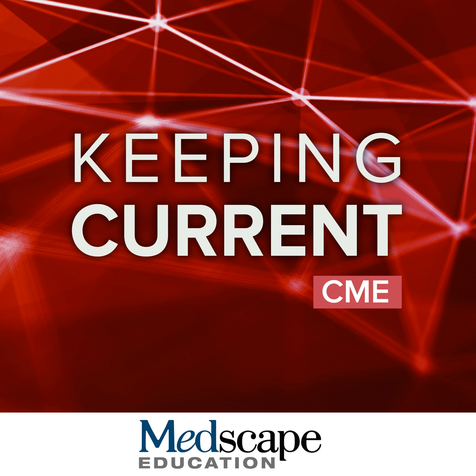There was no associated diffusion restriction. There were, however, a few microhemorrhages in the right occipital lobe. We also see a cluster of microhemorrhages in the left occipital lobe in the region of prior edema. So what is the diagnosis here?